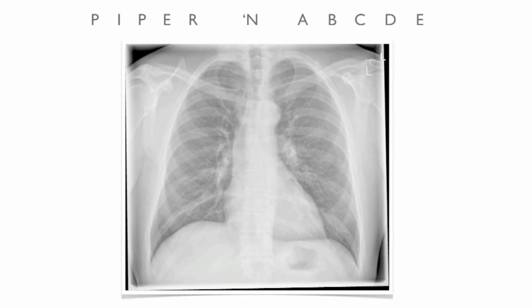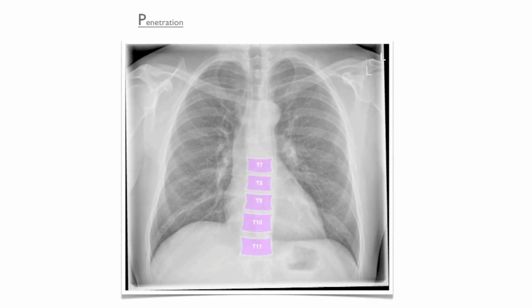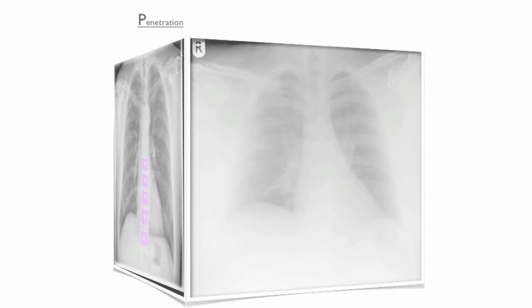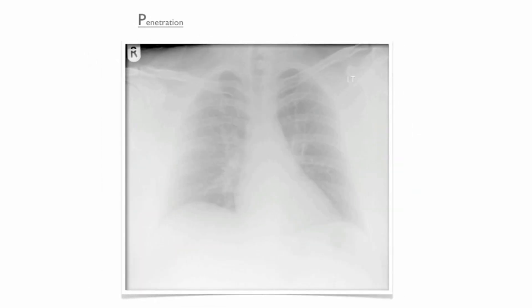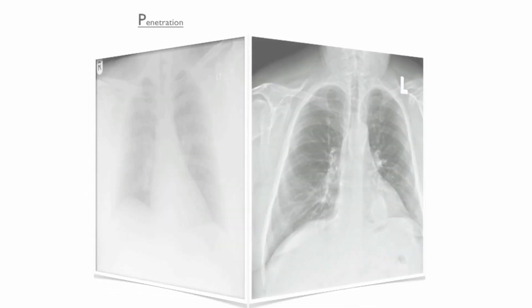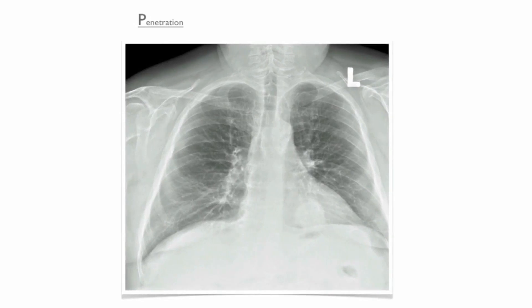The next step is to identify how well the X-rays have penetrated the patient's thorax. Penetration is assessed by identifying the outline of the thoracic vertebrae through the heart shadow. This radiograph is poorly penetrated — note how you cannot see the outline of the thoracic vertebrae. Good X-ray penetrance is important because it helps you identify pathology lying behind the heart shadow.